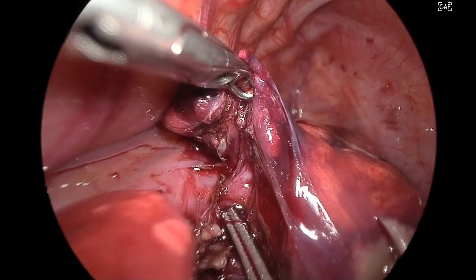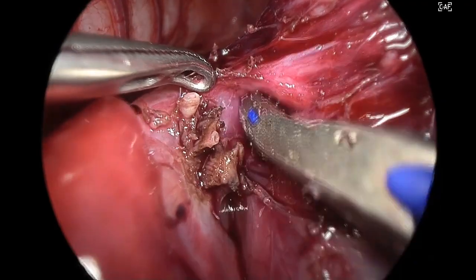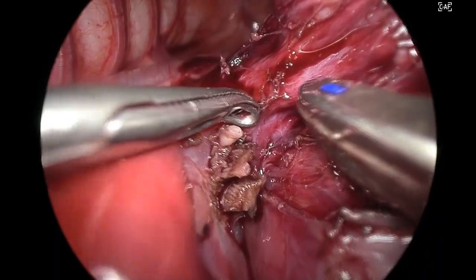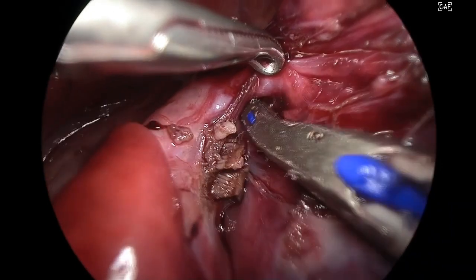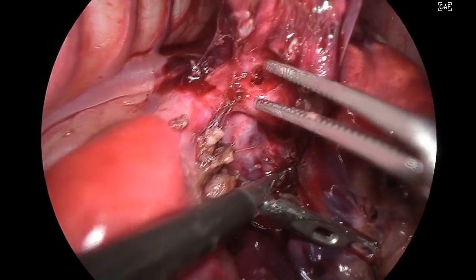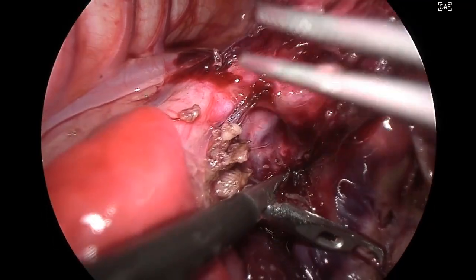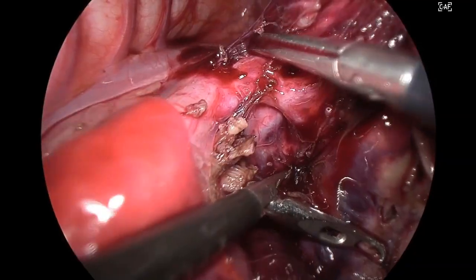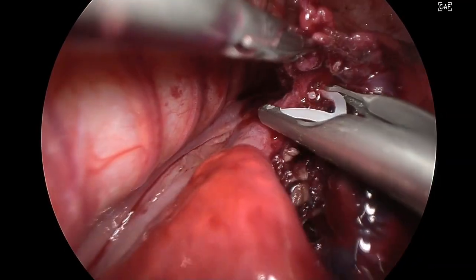Now this is the bronchus that we are dissecting right now. The first thing that we usually expect if you go posteriorly is the bronchus. So this is the bronchus, and just anterior to the bronchus we can see the pulmonary vessels, the artery, and if you're not careful you can easily damage these arteries. But you can see the view in thoracoscopy is amazing, and we can see these branches very easily. So going to the divisions of the bronchus so that I can apply a clip safely in this area.